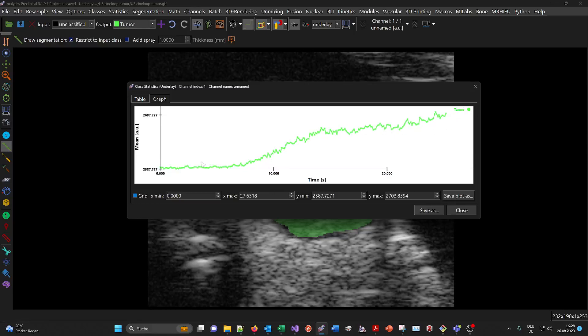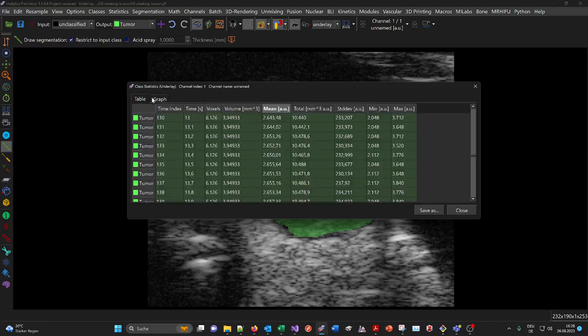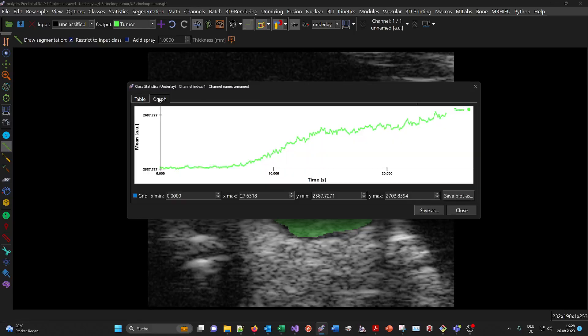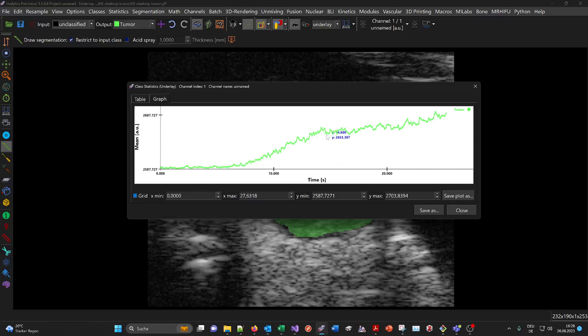You can save the table as an Excel file and do further processing. You could compute the time to peak or the slope here as statistical measures.